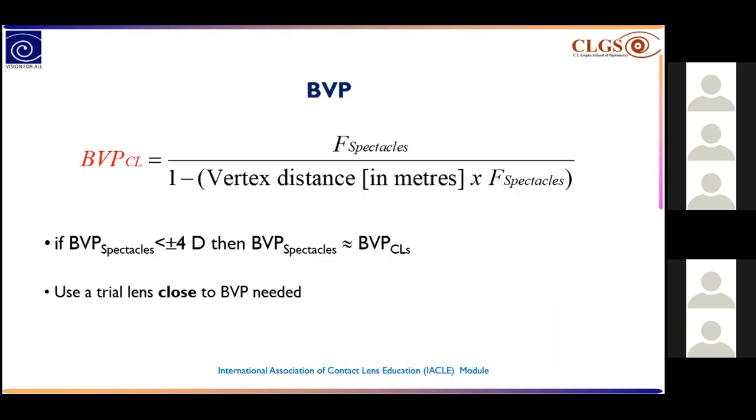So next is back vertex power of the contact lenses. The back vertex power of the contact lenses can be calculated by using this formula.